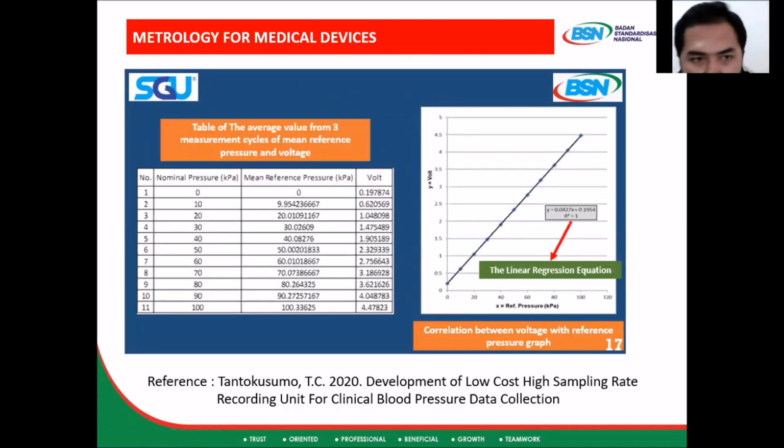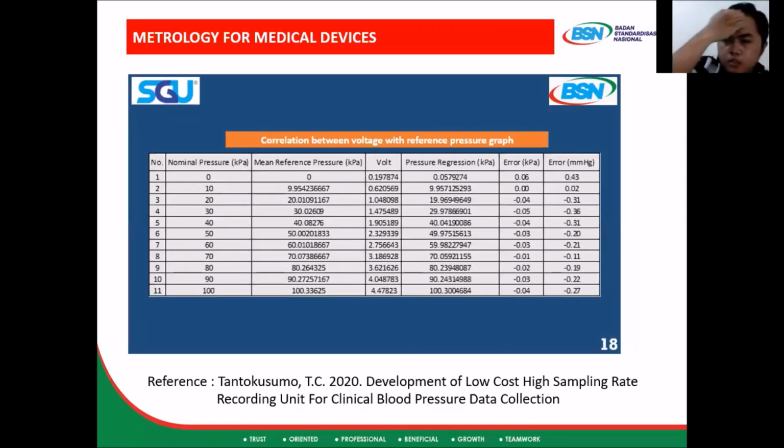And the result of the calibration from the 3 measurement cycles, we get the relation between the reference pressure and the voltage. So we can obtain the linear regression equation, and then we apply the equation for the regression. And the error between the reference pressure from our primary standard and the indication of the recording unit from the pressure regression is below 1 millimeter of mercury. So this complies with the ISO standard.